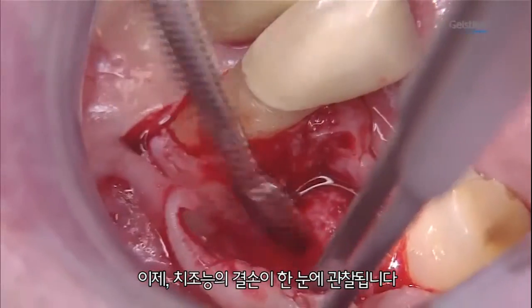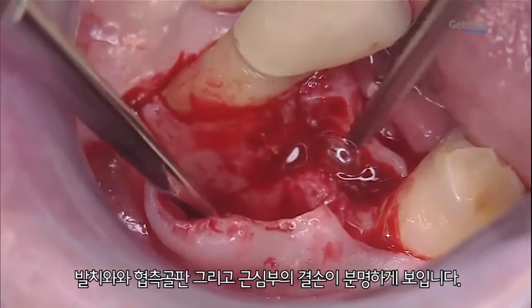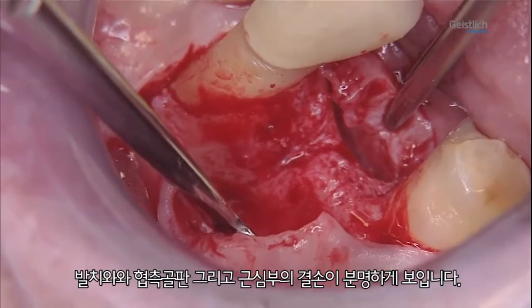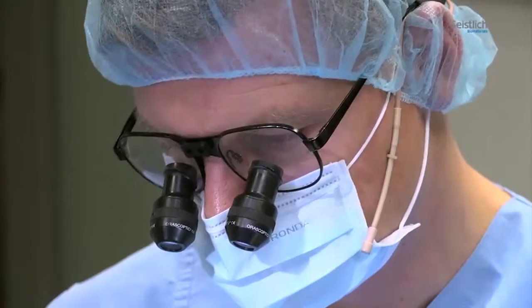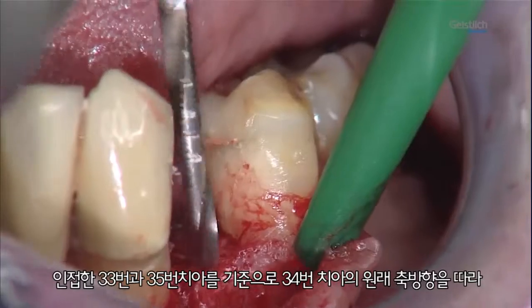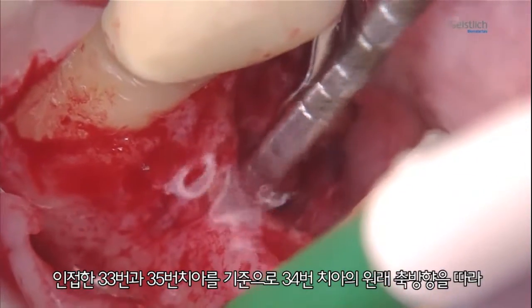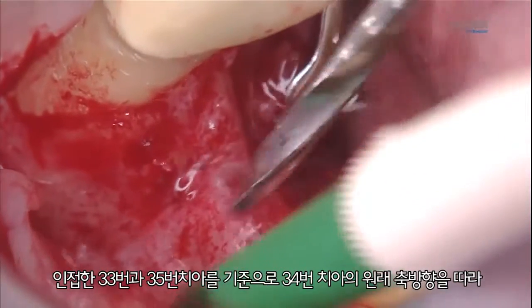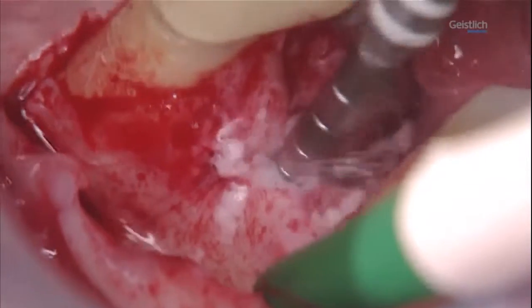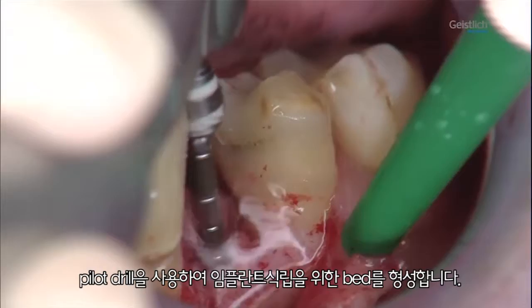The ridge defect now comes into view. The extraction socket and the buccal bone plate, with some tissue loss in the mesial area of the defect, are clearly visible. We prepare the implant bed with a pilot drill under irrigation, following the axial direction of the original tooth 3-4, with the adjacent teeth 3-3 and 3-5 providing additional guidance. The pilot hole is now complete.